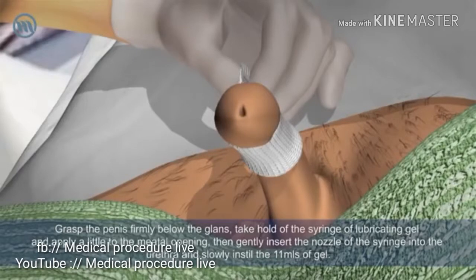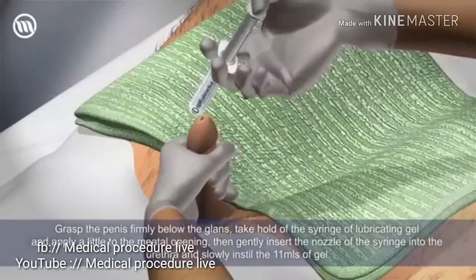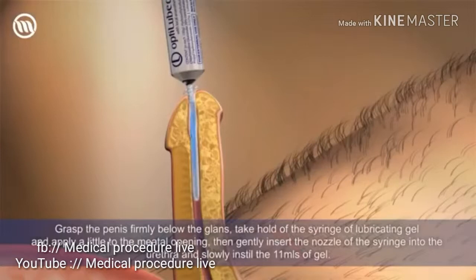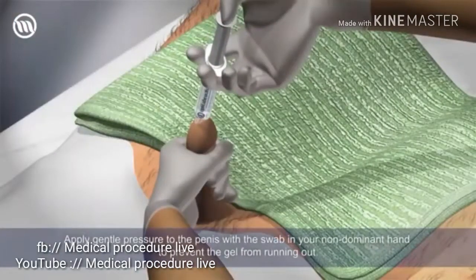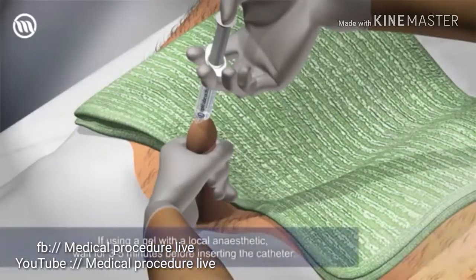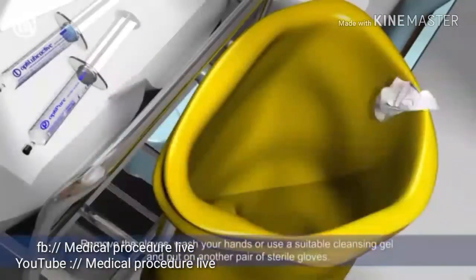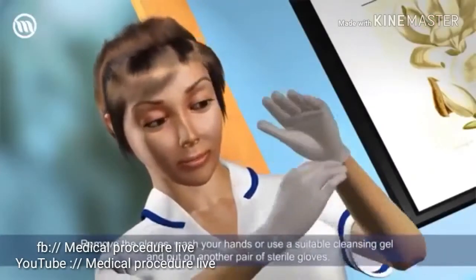Grasp the penis firmly below the glans. Take hold of the syringe of lubricating gel and apply a little to the meatal opening. Then gently insert the nozzle of the syringe into the urethra and slowly instill the 11 mL of gel. Apply gentle pressure to the penis with the swab in your non-dominant hand to prevent the gel from running out. If using a gel with a local anesthetic, wait for 3 to 5 minutes before inserting the catheter. Remove the gloves. Wash your hands or use a suitable cleansing gel and put on another pair of sterile gloves.